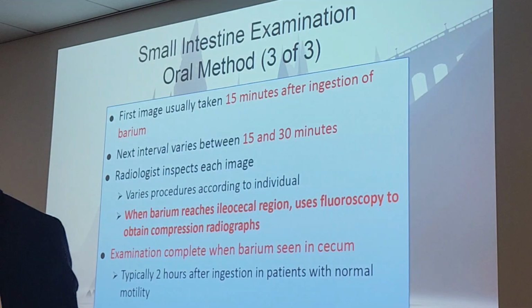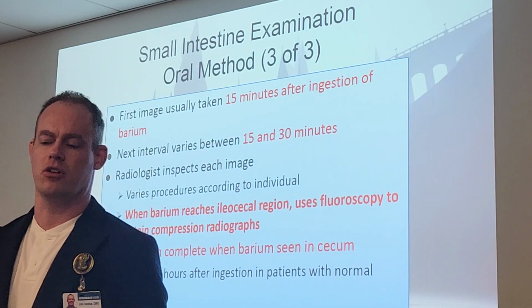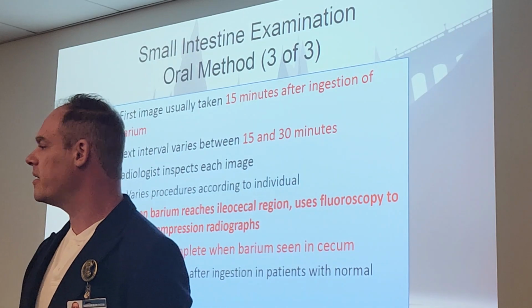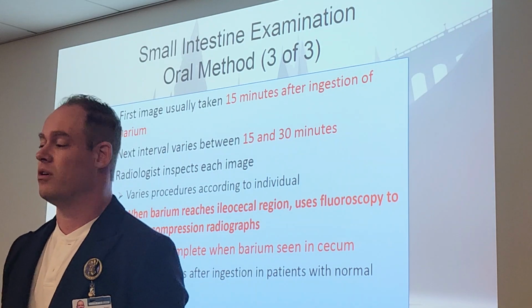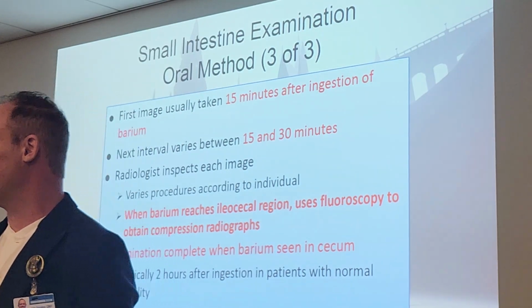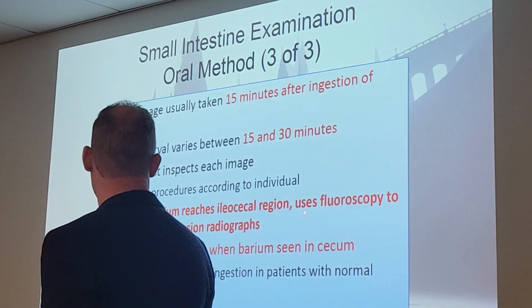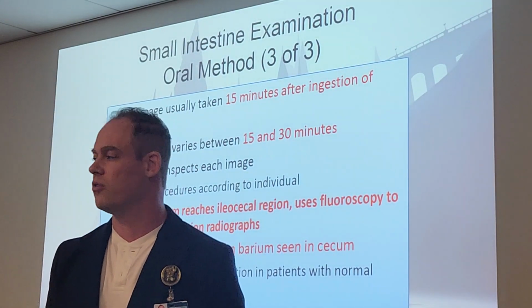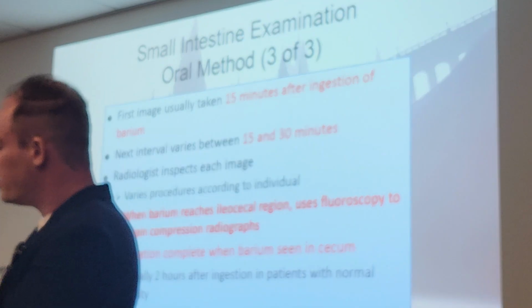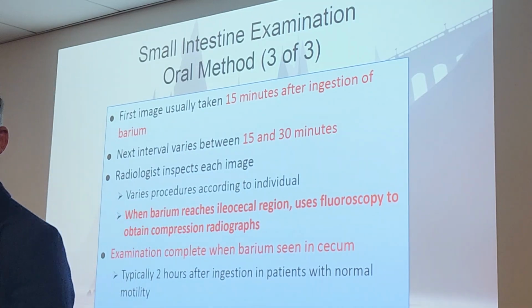The radiologist will inspect every image and tell you whether to continue letting them lay there or to have them go back to their room if it's taking way too long, and so forth. They'll basically give the guide telling you what to do with that patient through the procedure. It can go on for hours, it can go on for days, it just depends on the patient. Now we are watching that barium flow through the intestines until it reaches specifically the ileocecal region. At that point, they're going to use fluoroscopy to obtain what we call compression radiographs to open up the bowels and get a spot film of that ileocecal valve specifically. And that's the little wand that inflates? That's a little balloon, yes.